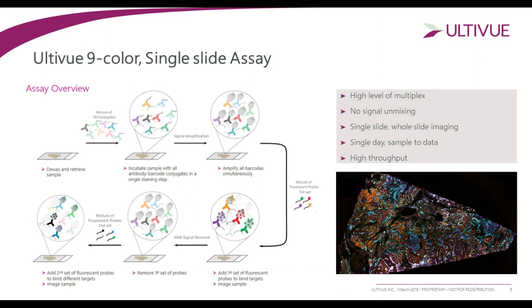And when it came down to imaging, you would apply a mixture of 4 imaging strands, using, for example, a FITC, a TRITC, a Cy5, and a Cy7 type fluorophore. These first 4 imaging strands will bind to the first 4 targets of interest in the tissue that you want to look at. So maybe your CD4, your CD8, cytokeratin, and CD20, for example. You would then do a round of imaging where you'd image those 4 specific markers within those 4 channels.